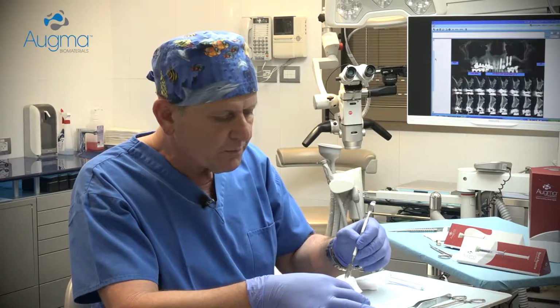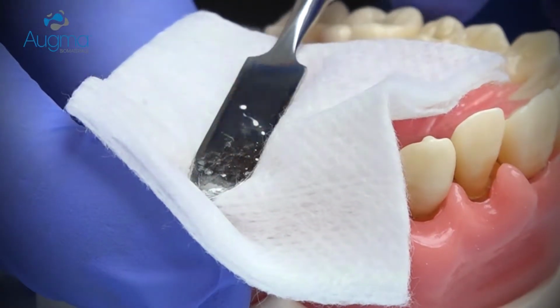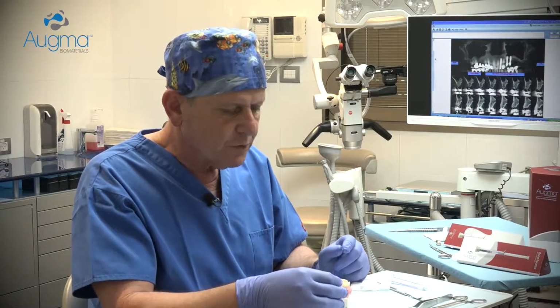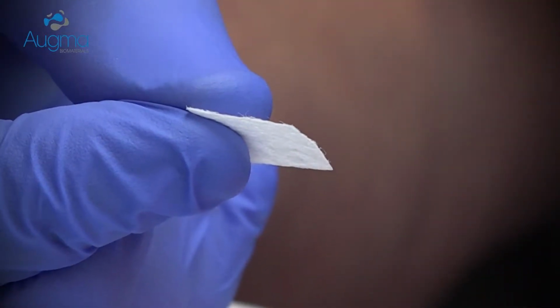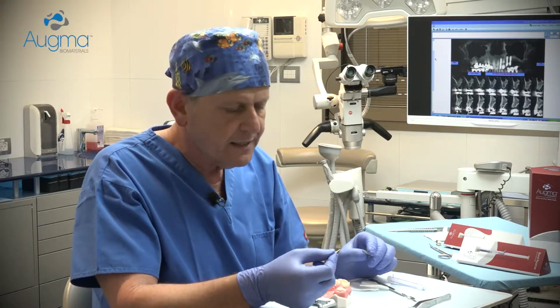Now, if there is not enough room for your finger between the teeth, use a spatula or an elevator periosteal and press above the dry gauze. Now, you cannot leave the material exposed. What you need to do is to take a barrier, which can be a simple collagen sponge, and place it above the graft. However, it must be sutured together with the soft tissue. So the technique is in that way.